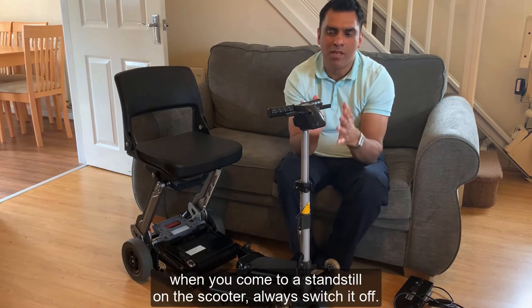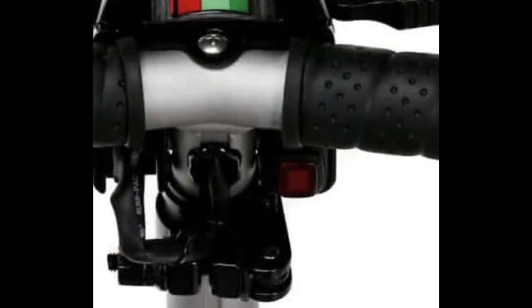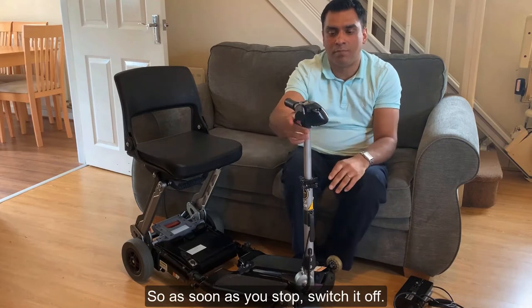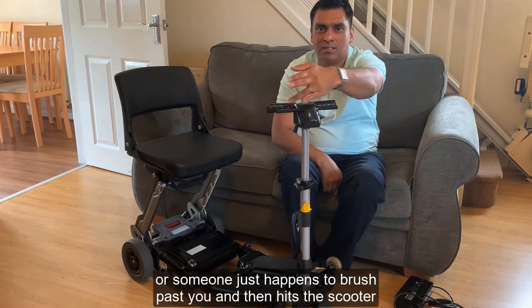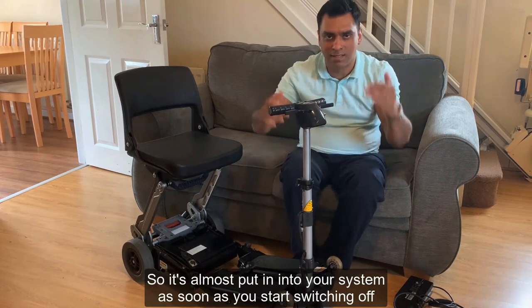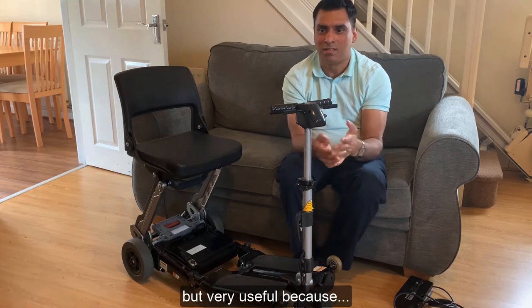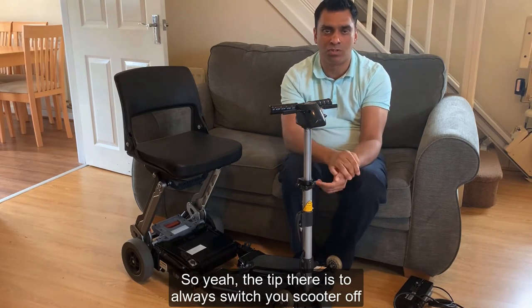Another tip: when you come to a standstill on the scooter, always switch it off. Say you're at the tills in Tesco about to pay - switch it off. If you forget, a carrier bag could knock the throttle and you shoot forward, or someone brushing past could bump it. It's a dead easy thing to do - just build it into your routine: as soon as you stop, switch off. Especially with kids around, you don't want an embarrassing situation.